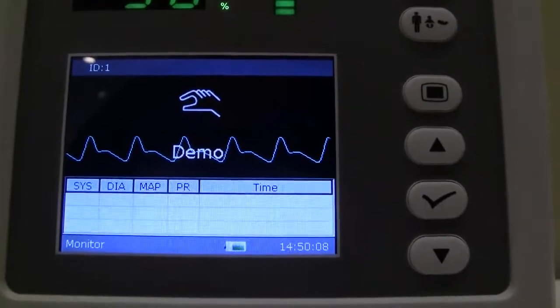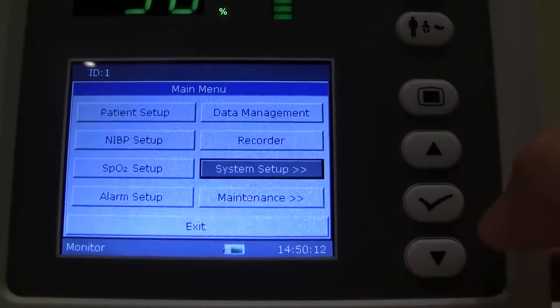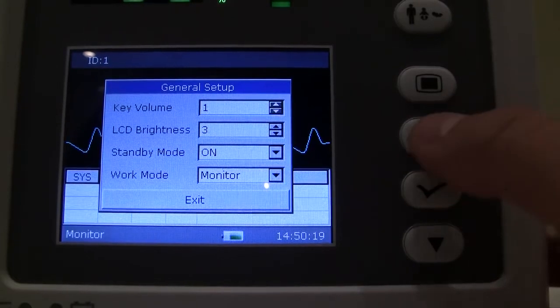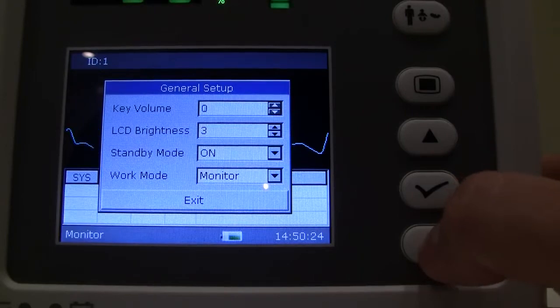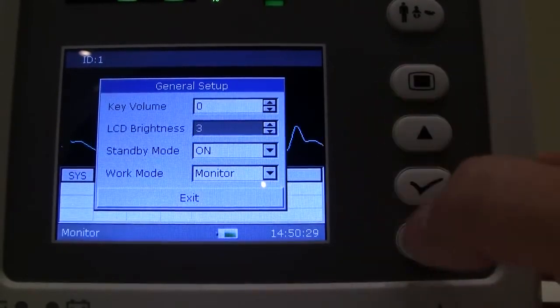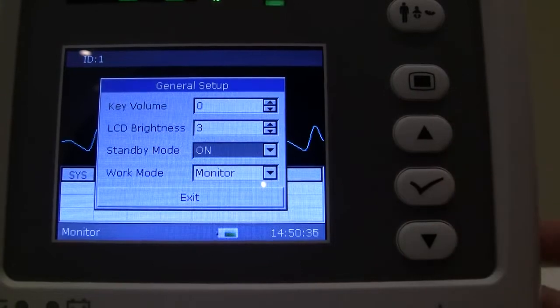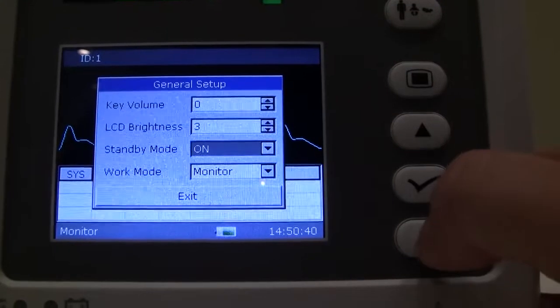The unit can be set up to user's preference. You want to go to System Setup, go through the options here as far as general setup goes. Key volume, obviously I have that turned down right now, but if you want you can select it so that it makes a noise every time you press the keys. LCD brightness, you could change it there. Standby mode is on, meaning that if I hit the power switch it'll ask me if I want to keep the monitor in standby mode so that it'll very quickly boot up upon my next patient.